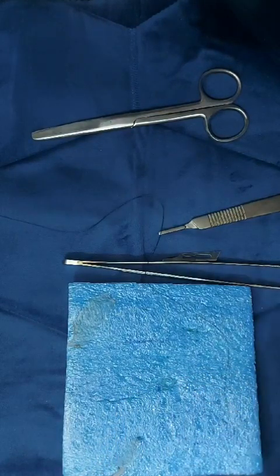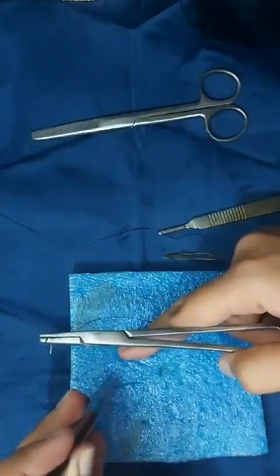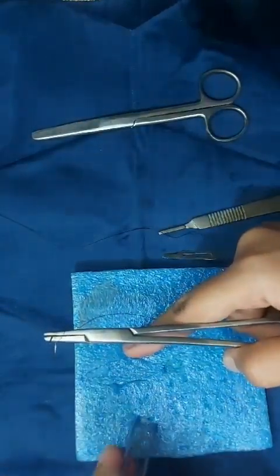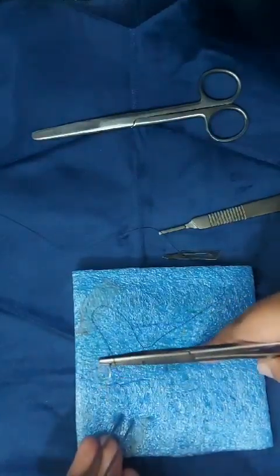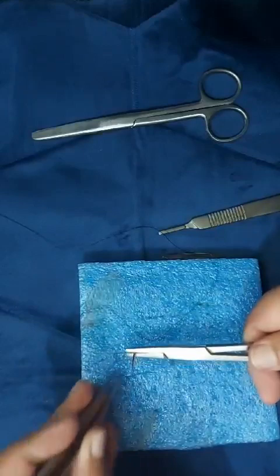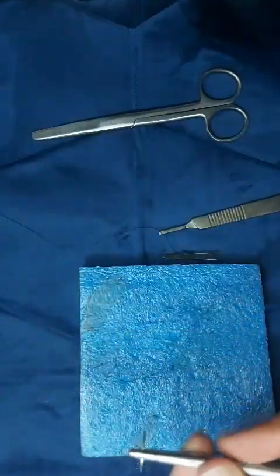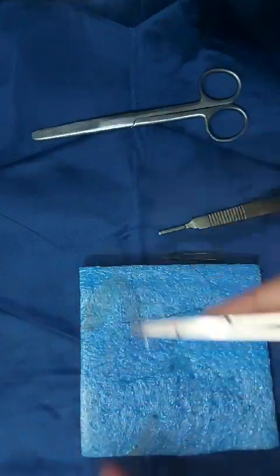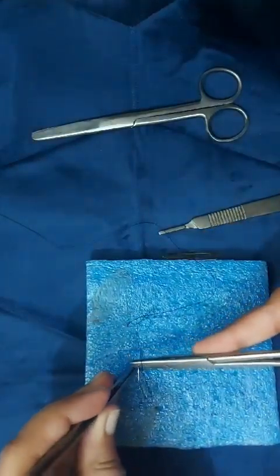Then stabilize the wound edge and hold it with the forceps, and the needle should traverse down through the epidermis and dermis, and then take a small bite of the tissue. Stabilize it like this and then take a small bite.